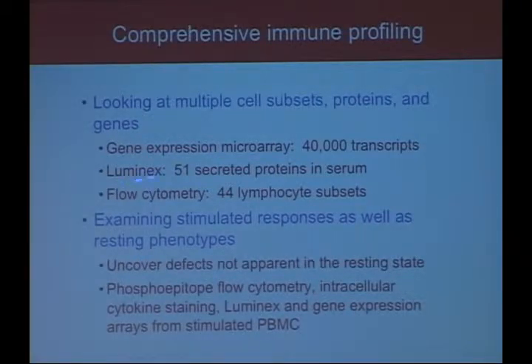Luminex, I'll show you, is a bead-based immunoassay. So it's very much like an ELISA, but it's multiplexed with many analytes in a single well.